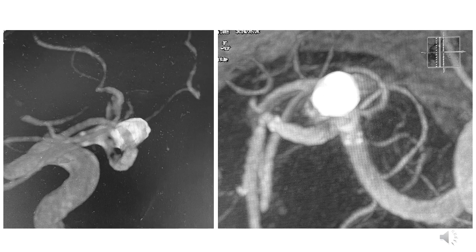Usually it will be the proximal one. Occasionally it is the distal limb beyond the aneurysm, depending upon the branching pattern and how the size forms. This is what I evolved in my practice, evolved over a period of time.